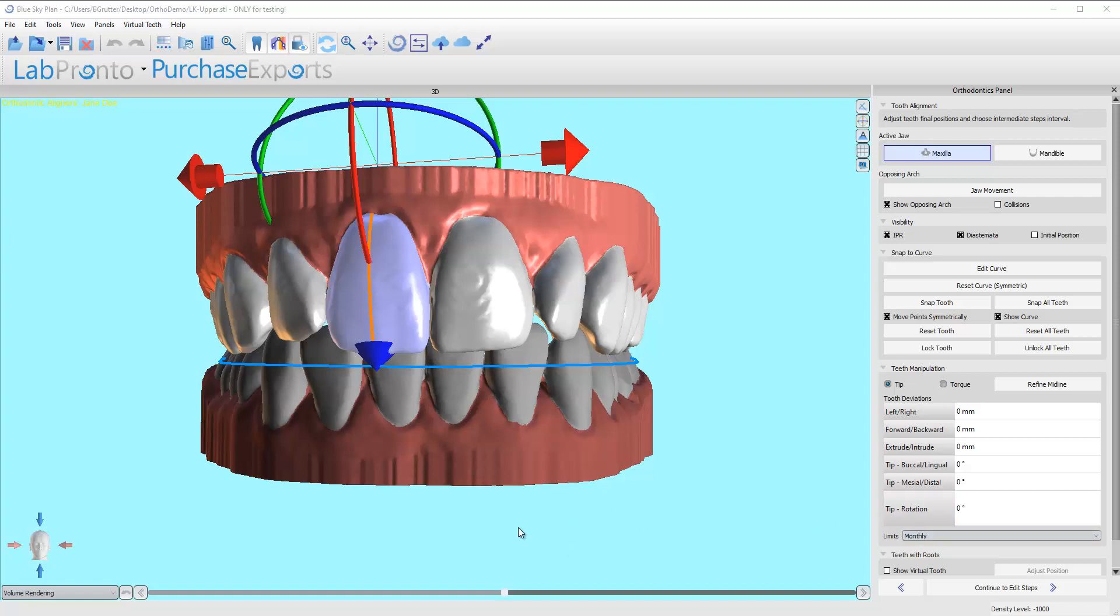Okay, so we are now in the tooth alignment phase. In this phase, we're going to have the opportunity to actually straighten up the teeth. This is the whole purpose of the software, if you will.